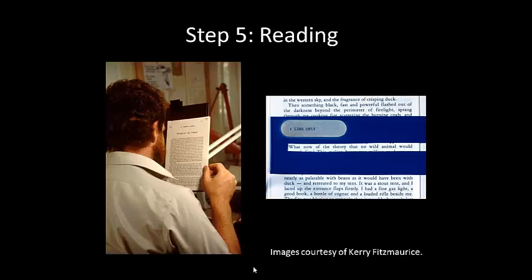This slide here shows 2 things. One on the left is showing a reading board. So book stands and reading boards like the one shown on a flexible arm can be helpful for positioning text in the right place, depending on how close the patient needs to hold the object that they're reading. And on the right hand side, we've got an example of a line guide.